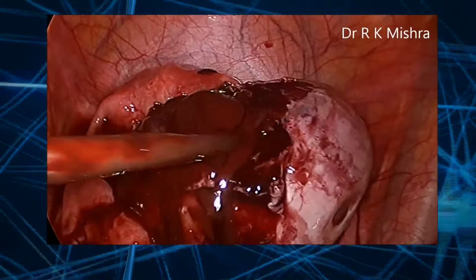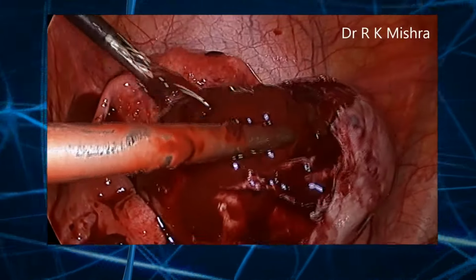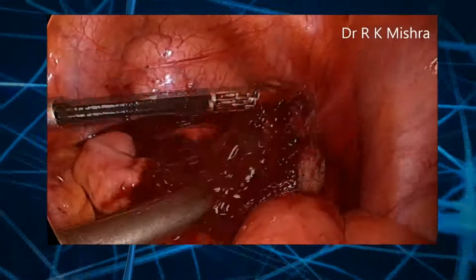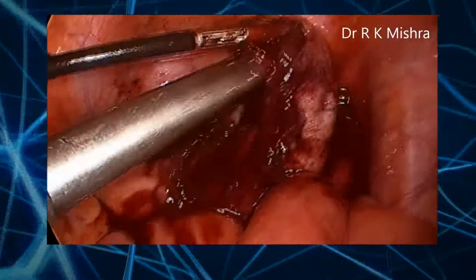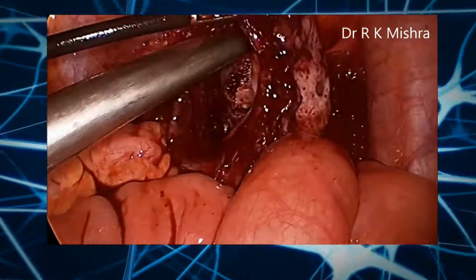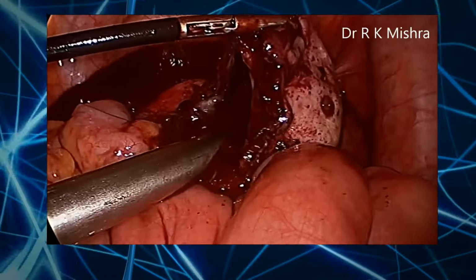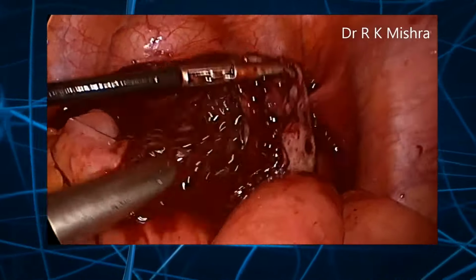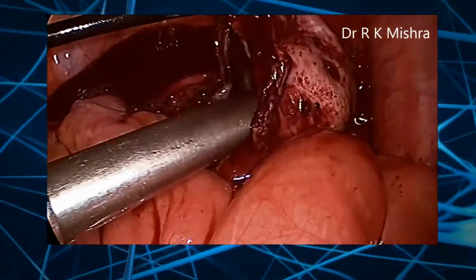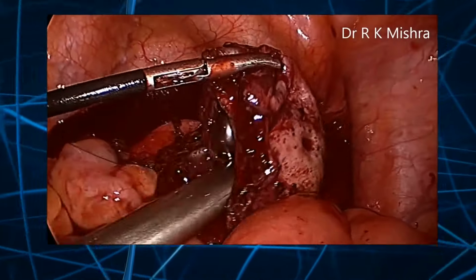Again irrigate and suck. Now it is easy, because it is diluted, and you should keep on shaking it by holding it and do up down and then do irrigate suck, irrigate suck, irrigate suck. So, dilution is the best method to control the pollution. So, you can dilute it and then you can suck it repeatedly. So, this way it is sucked.